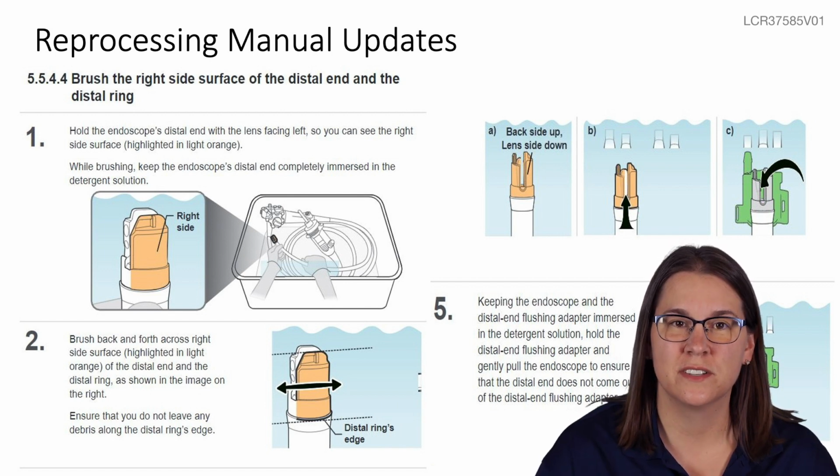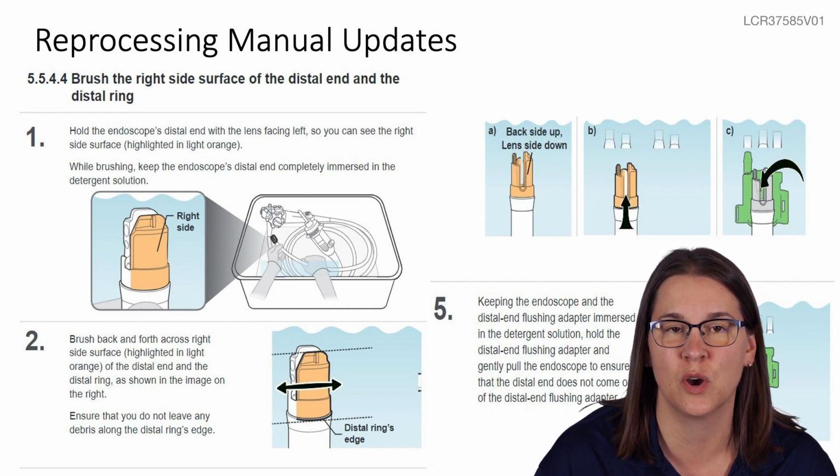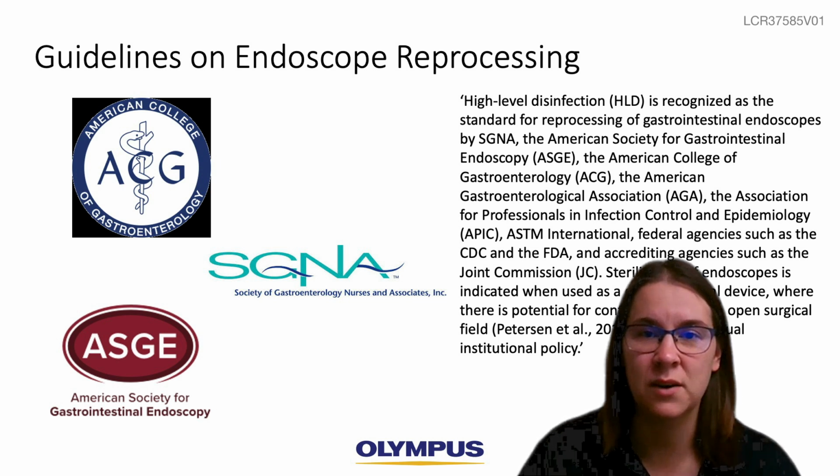These IFU changes are exciting, Eric. Thanks for sharing this with us. We're excited to share these tools and partner with our customers on reprocessing training to continue these learnings to improve duodenoscope reprocessing. Before moving into reprocessing efficacy and safety, I'd like to touch on current reprocessing guidelines for flexible endoscopes.